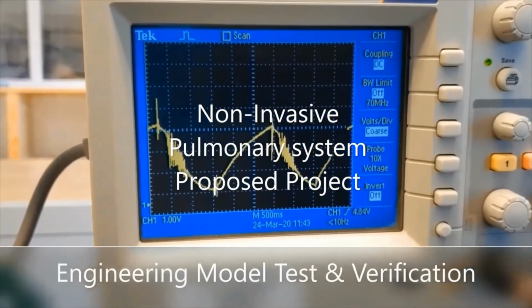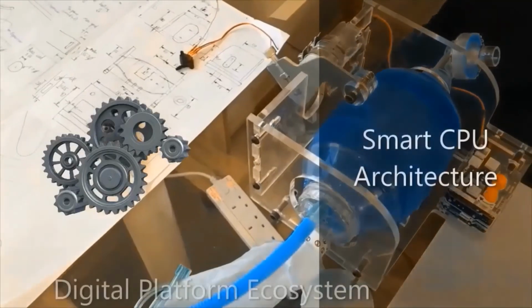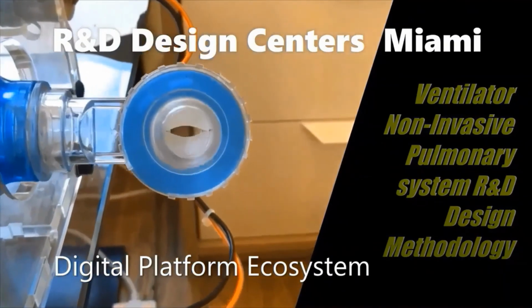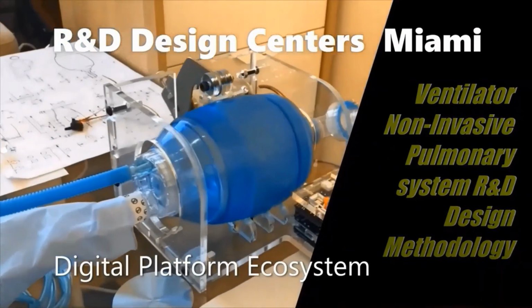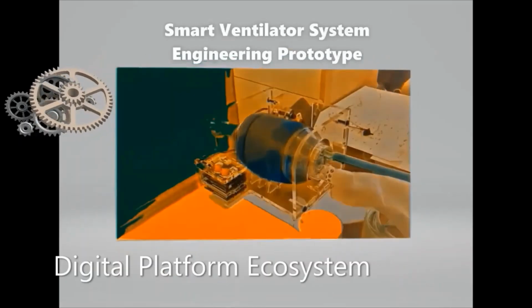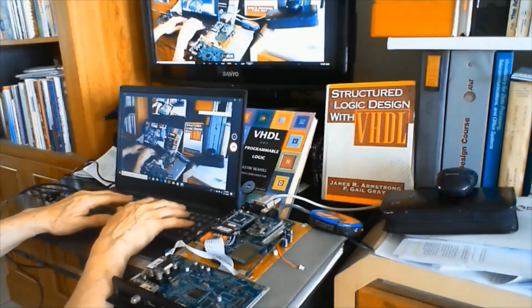The software platform consists of complex mathematical algorithms and sophisticated software models. Many of these models are developed with Python and C++. The main objective is to provide the control environment for the motor and sensory segments. Here, I will illustrate an engineering alpha test model of the proposed ventilator system.